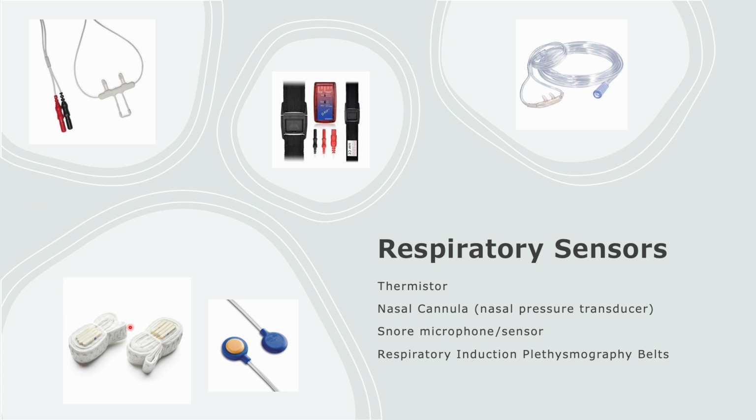And these are the RIP belts. Also could be piezo belts or respiratory inductance plethysmography belts. They may be able to hook directly into the head box, or they might have a little box like this that has a battery pack that I have to plug into first.